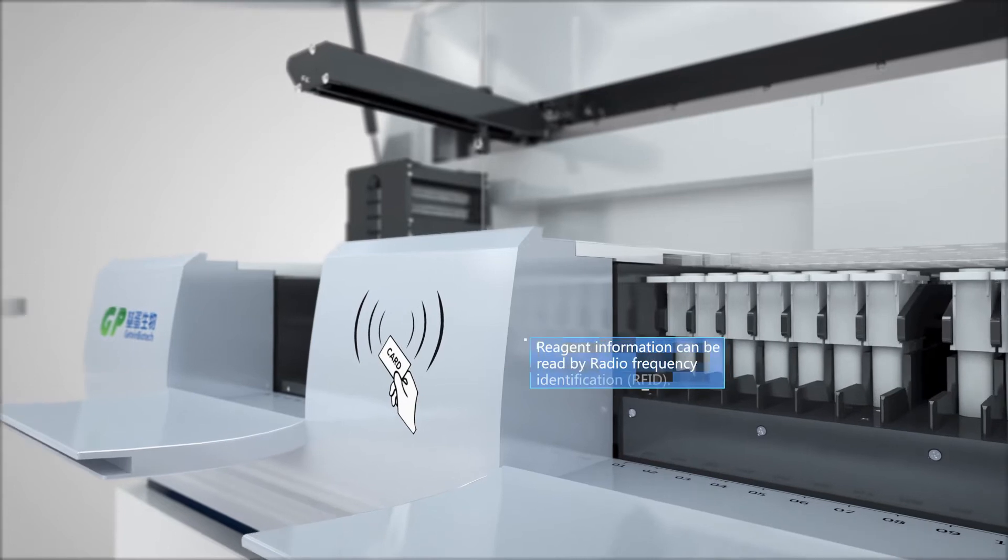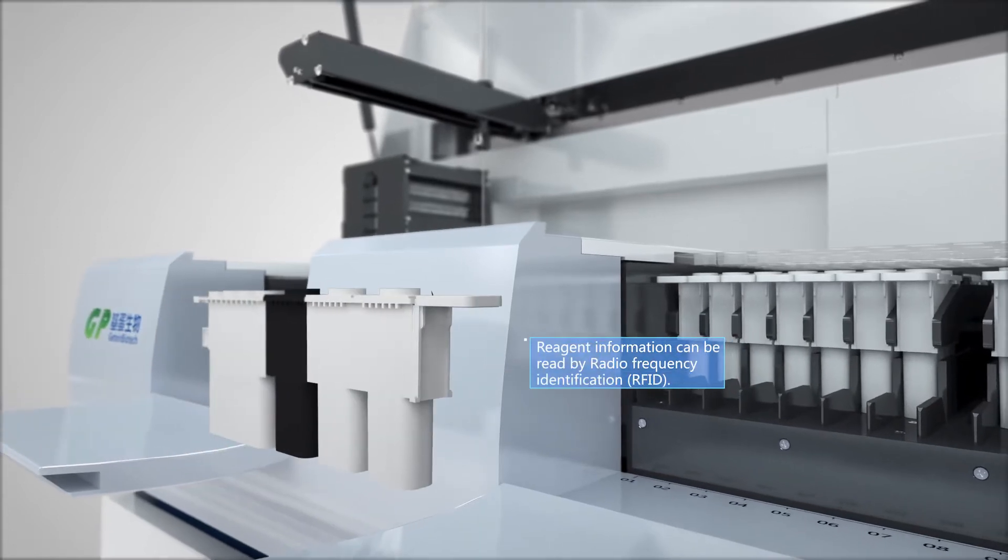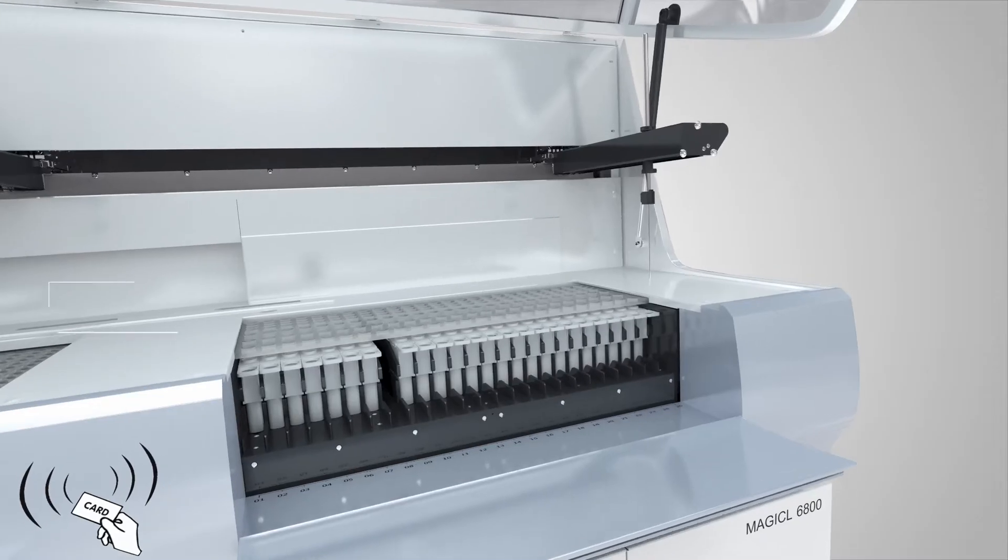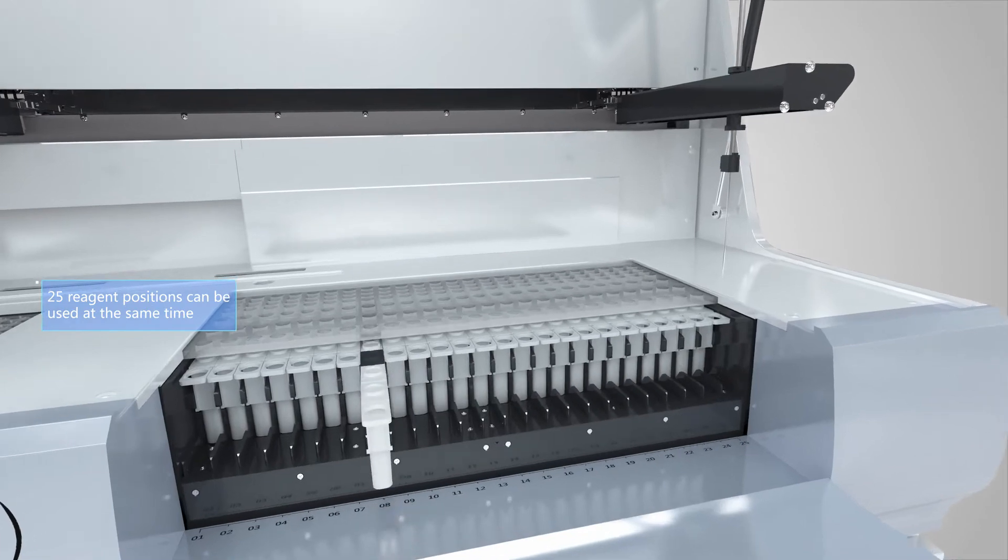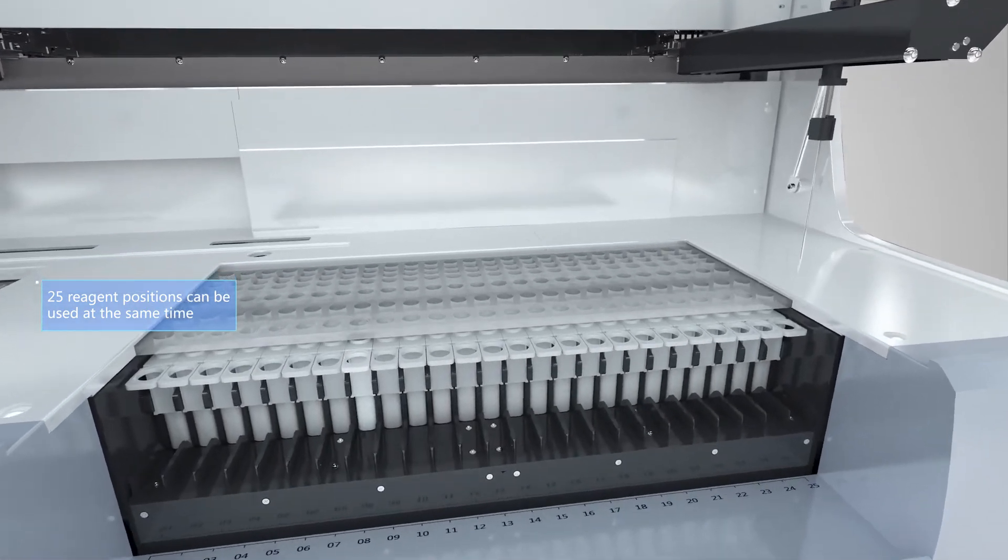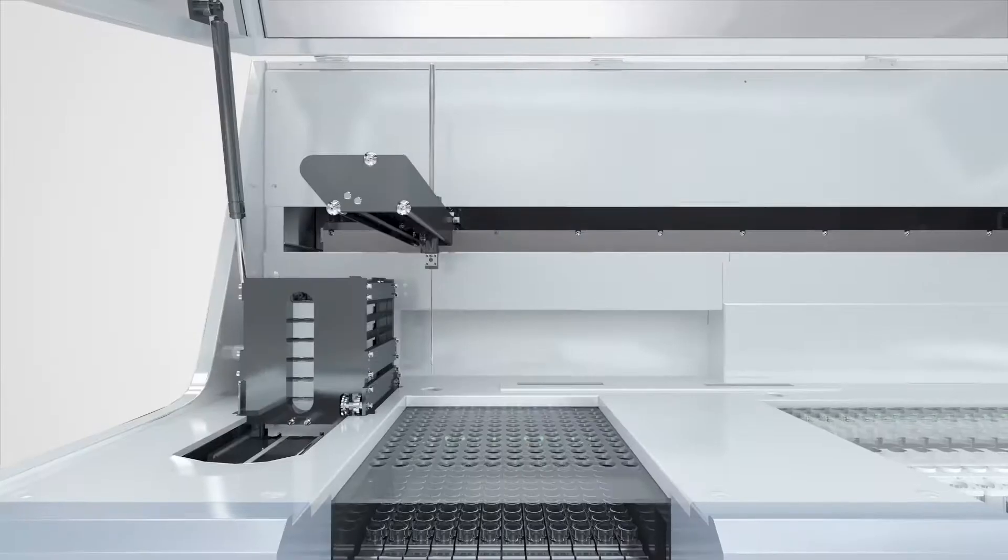Reagent information can be read by radio frequency identification and 25 reagent positions can be used at the same time.